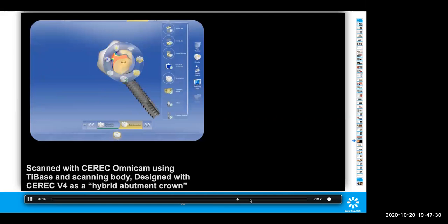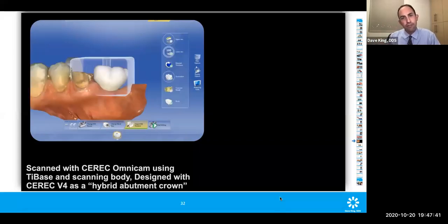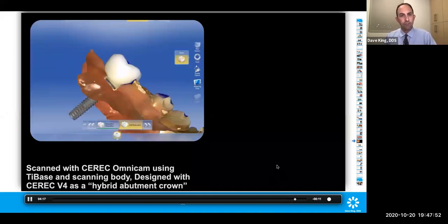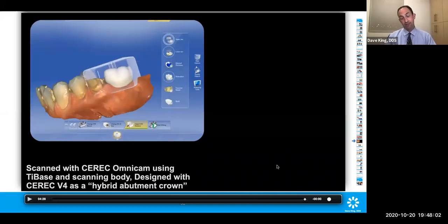And have you ever had any discrepancy between analog and digital impressions? I've never really, now between fit and delivery, I have, and I can trace all of those discrepancies back to the impression piece, whether it's a digital piece or an analog piece, not being seated correctly. So that's why it's so important that we verify the seat correctly with an x-ray, and also make sure you have the right size of pieces. With that Astra implant I was telling you, there are a couple of different sizes. There's the Astra and then there's the Astra EV, and both of the regular platform sizes are a gold color impression post. So it's fortunate they made the screw threading a different size, otherwise people would be using the wrong impression post. So yes, I have, but it all comes down to not having delivered or taken the impression correctly.